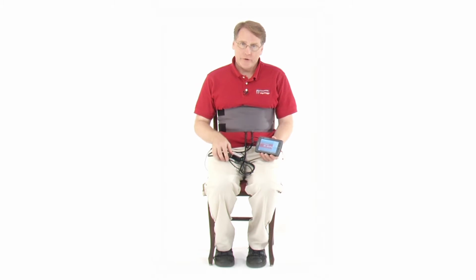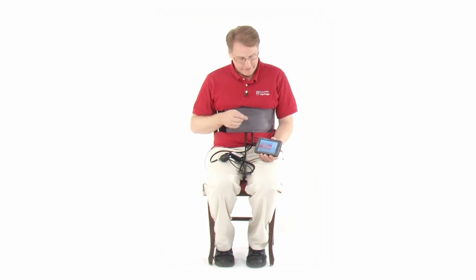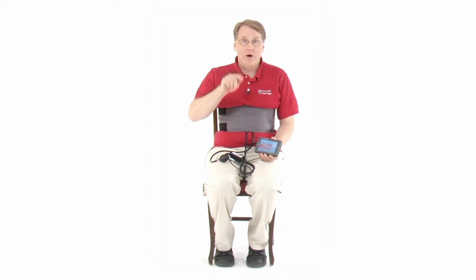And I want to pump it up so that the pressure in the cuff is about 6 kilopascals higher than background. So I'm running at about 99, close to 100 kPa. So if I pump it up so that it's about at 106 or greater than that, then that should be enough pressure in the cuff for it to work. Because what's going to happen is, as I breathe in and out, I want that cuff pressure to go up and down as I breathe, and I need that change in pressure to be great enough that it can actually count those. And we want it to be at least about 3 kPa in change in pressure as it goes up and down. So at this point, I need to pump up the cuff to get it ready to see if we can work this.